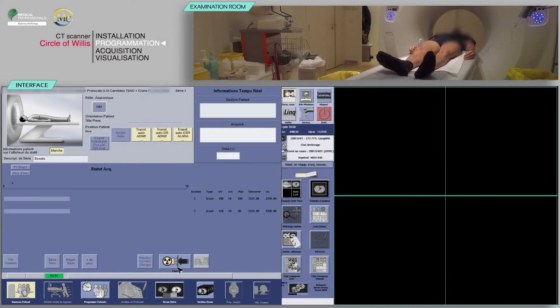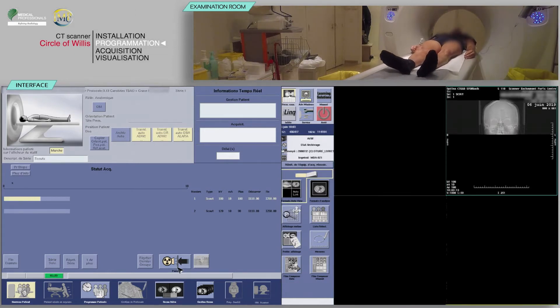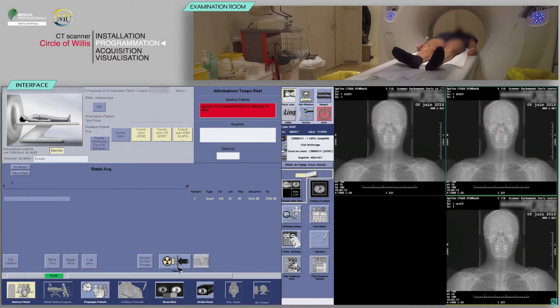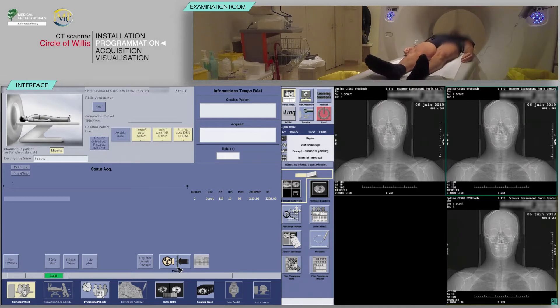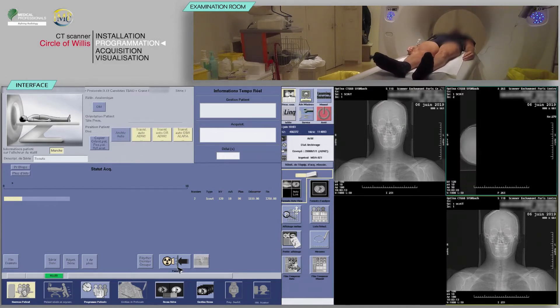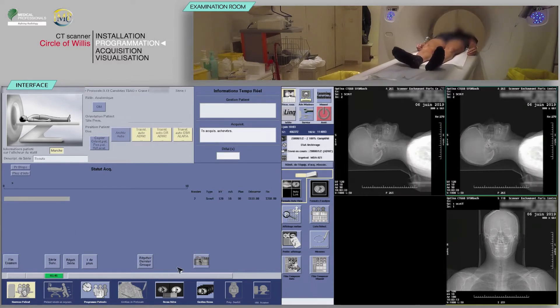On the keyboard, move the table and launch the acquisition when the buttons flash. Repeat to obtain a lateral scout view, then click on next series.